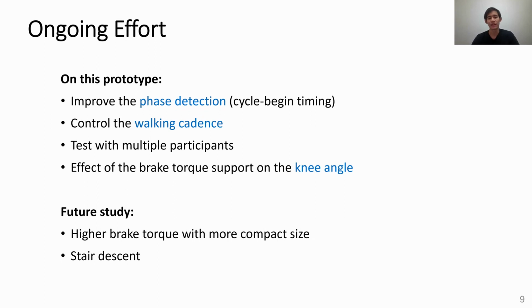And for future study, for the improvement, we may need a brake with a higher torque, but a more compact size. And we also see the possibility to extend the concept of the brake support to stair descent also.